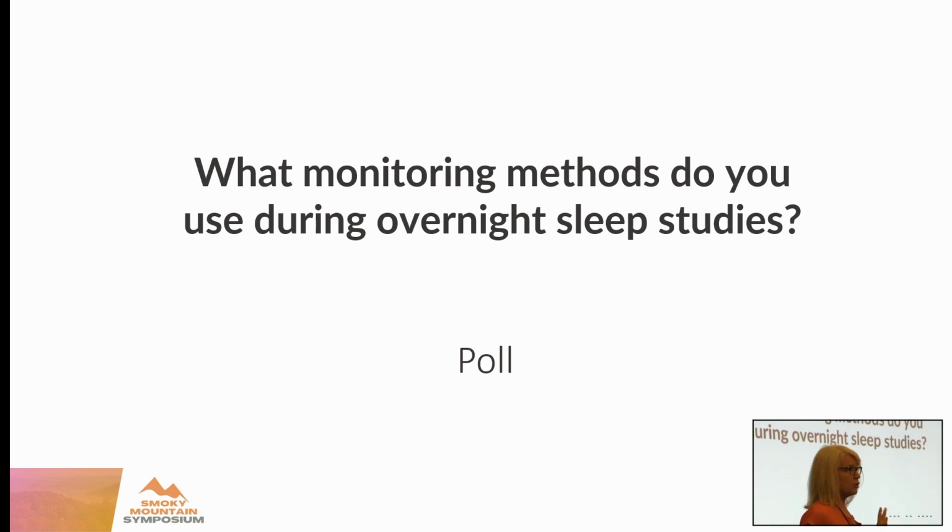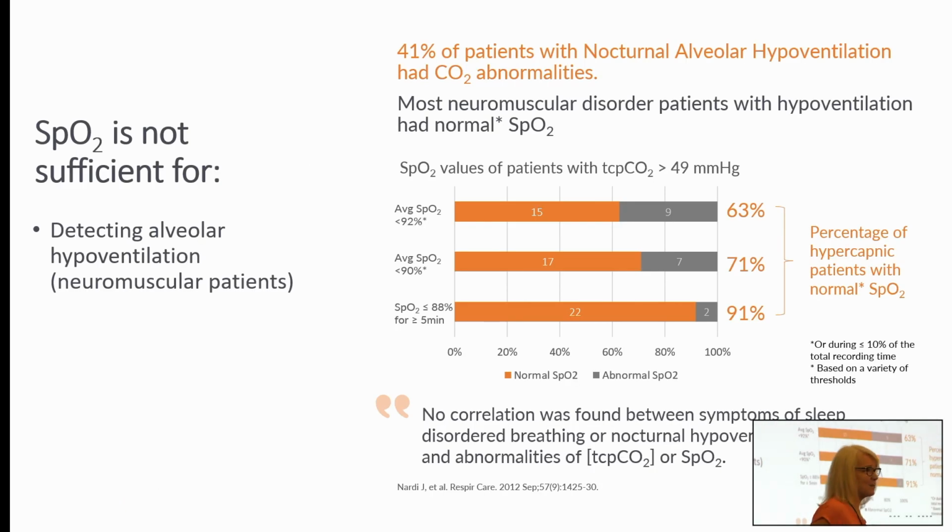Let me ask you how you're monitoring patients in the sleep lab. I'm not even going to ask you about oxygen saturation because I know you're monitoring that. How many of you are using end-tidal for CO2? Okay, anybody using transcutaneous out there? Okay, good. Got a lot of newbies, so I could really say anything about it and you'd probably believe me, right?